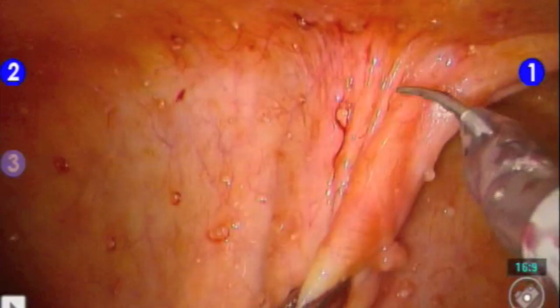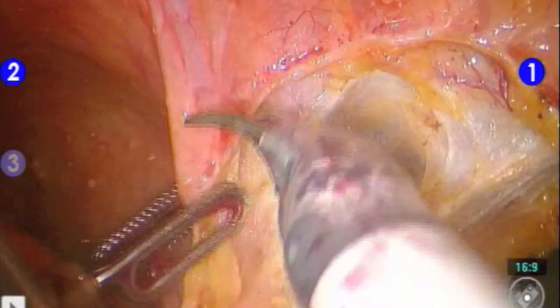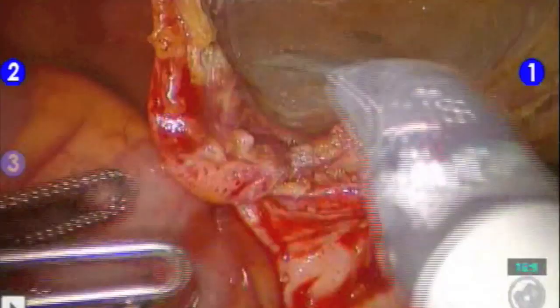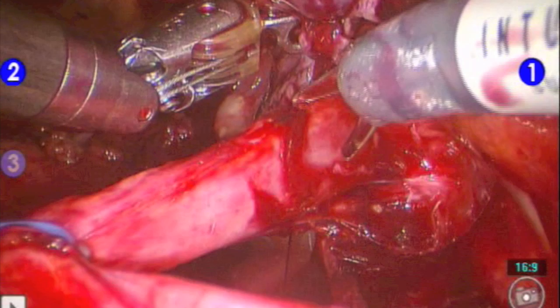We then drop the bladder from the anterior abdominal wall in a similar fashion to a robotic prostatectomy. The bladder is grasped and pulled over to the ureter to assure that it reaches prior to cutting the ureter.